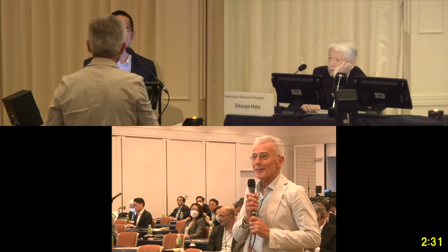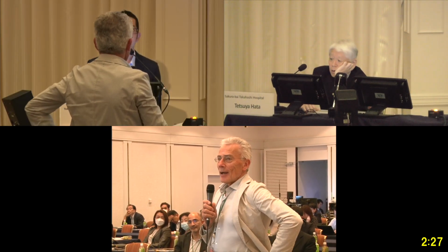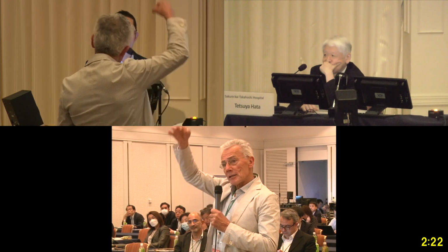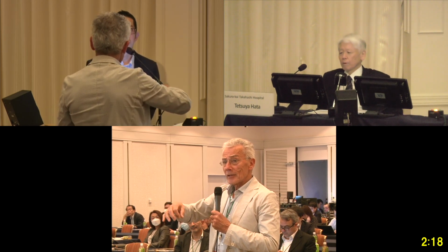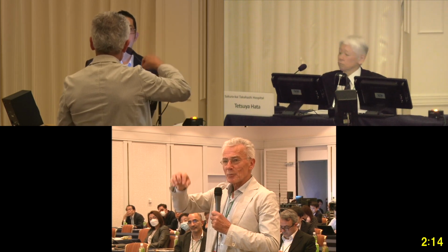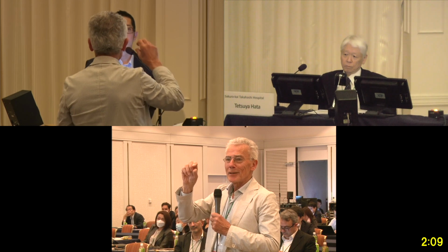Thank you very much for this beautiful and very instructive lecture. I have a question. When we saw Dr. Takahashi's case, he is puncturing perpendicular on the radial artery, and you see that the needle is compressing the artery, and you don't have so much space because the artery is only 2 millimeter in diameter.